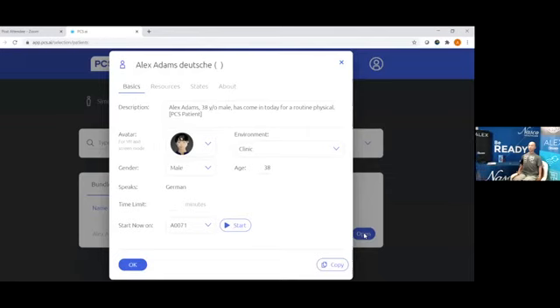When you open that scenario up, you would go to, say, your states. So he has no speaking capabilities inside of him at this moment on the international side of it. It's more of a blank template, allowing you or your users to go in and type in your own language the questions and answers that you would want to help him build his artificial intelligence.